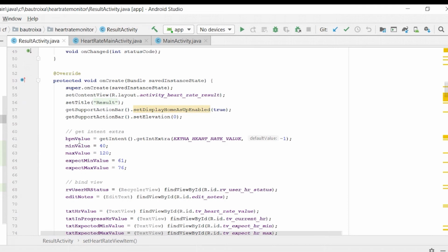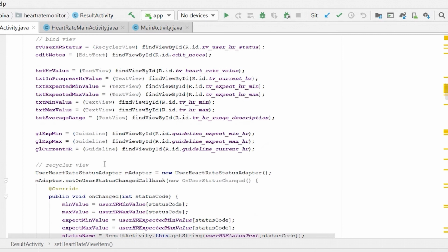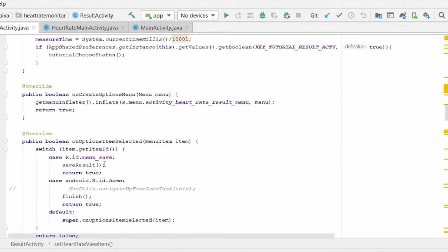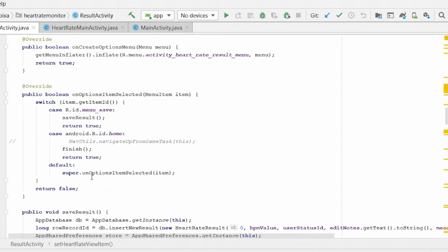Here, the default values such as minimum value are set to 40, max value is set to 120, expected minimum value is 61, and the expected max value is 76. So now, here we can see the save button. When we click, it just calls the save result function, where the result is saved, and it returns the true value back to the function.